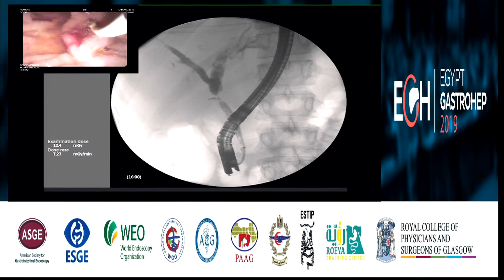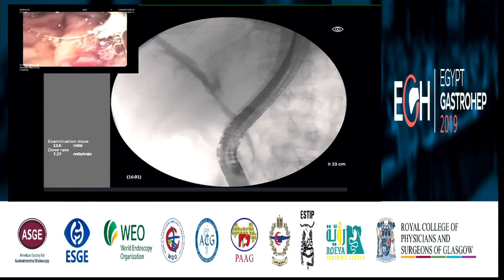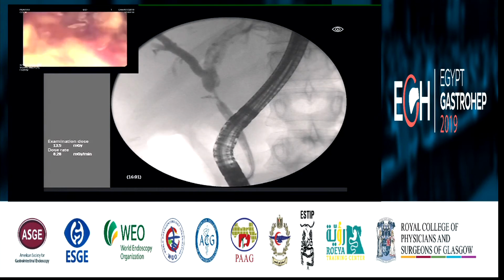Okay, we are above. We're into the left side of the intrahepatic. Deflate the balloon. Okay, we're going in. Now you see. Okay, it goes in easily, right? Easily. So I will test now. Please inflate a little bit.